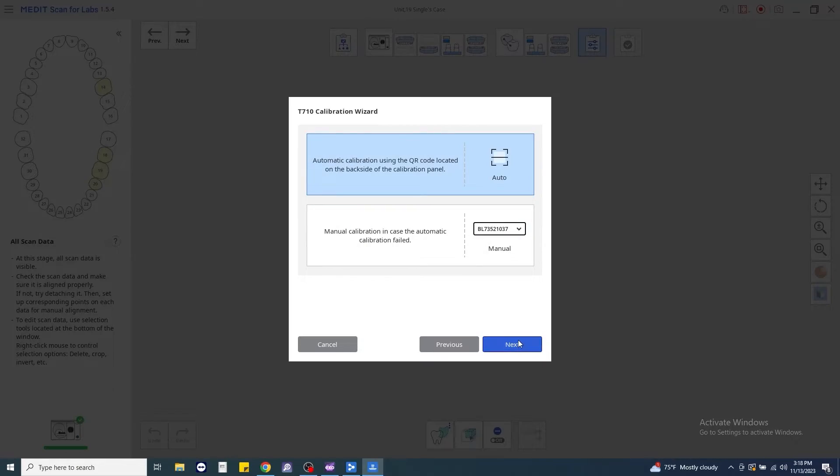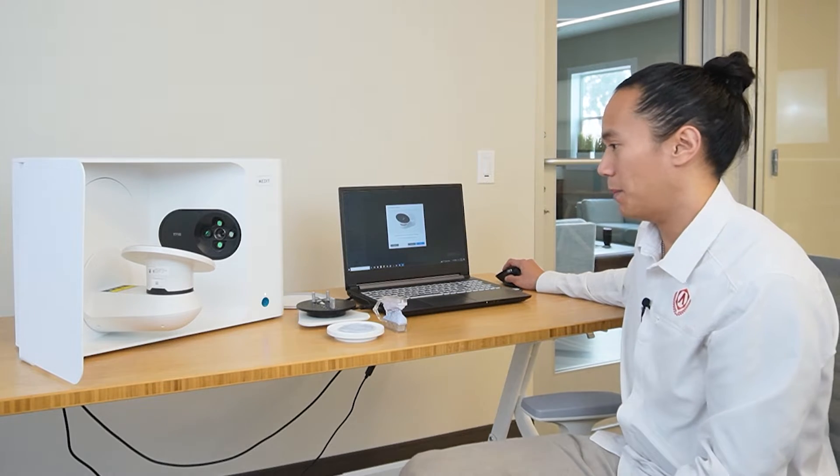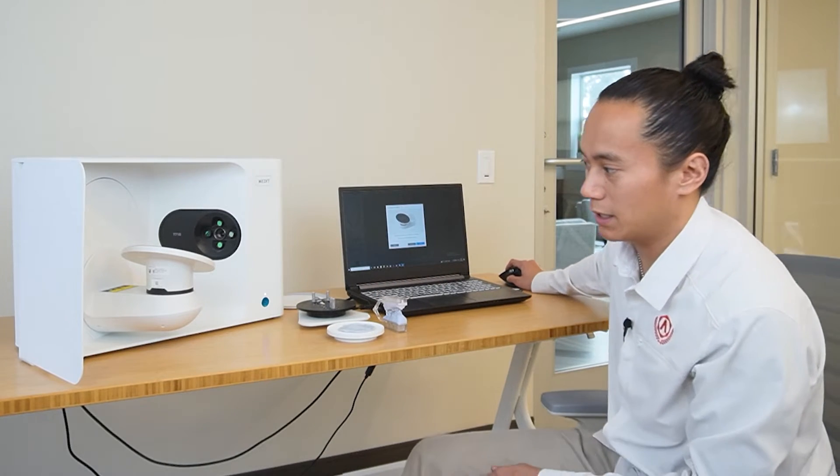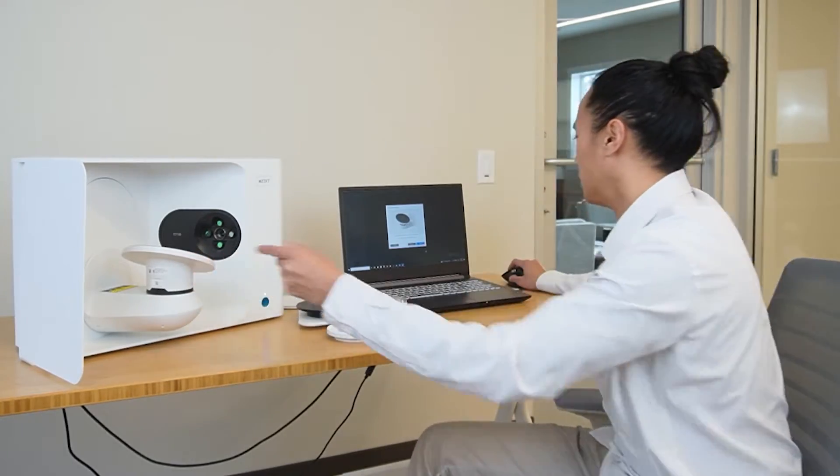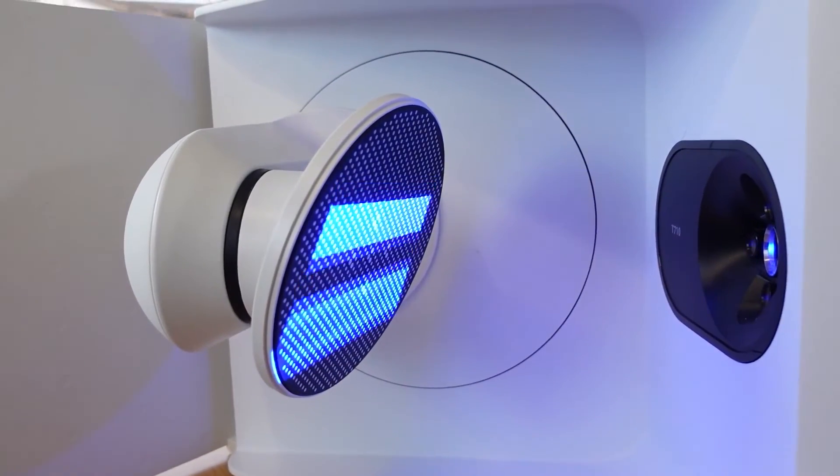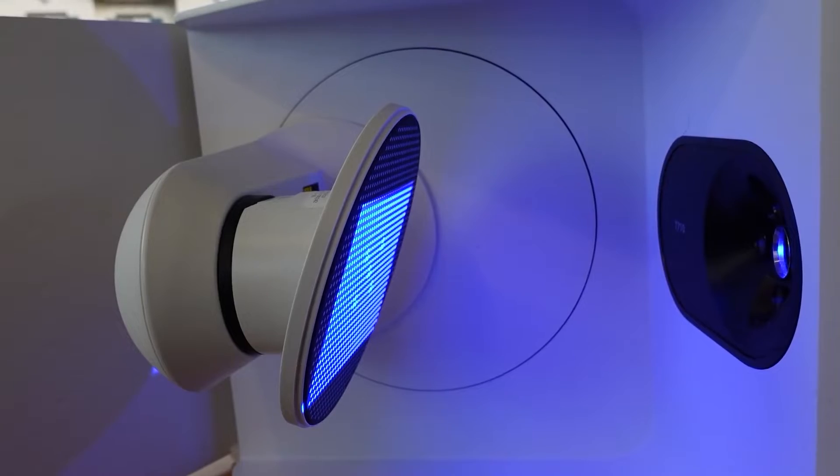You can manually level your calibration, have the projector read the QR code on the back of the scan stage, or you can have the software automatically do it for you. So we're going to select Automatic Calibration. Click Next. Make sure that the calibration plate is centered and stable, and we'll click Next here. This process should take just a few minutes.